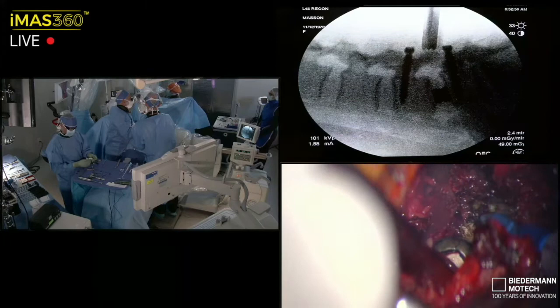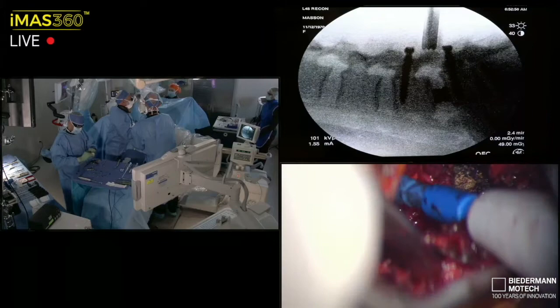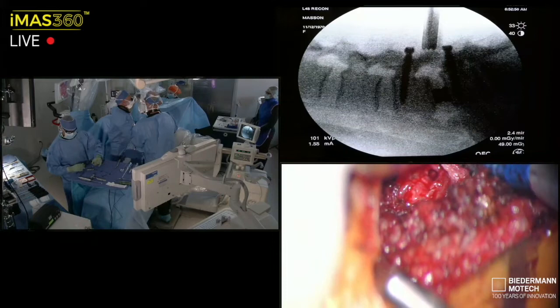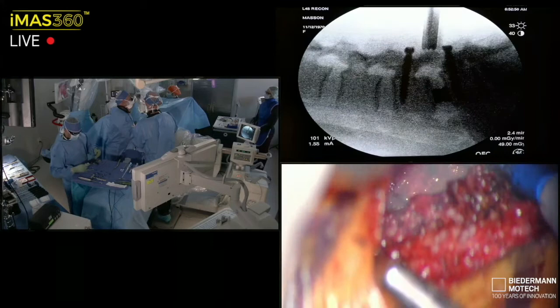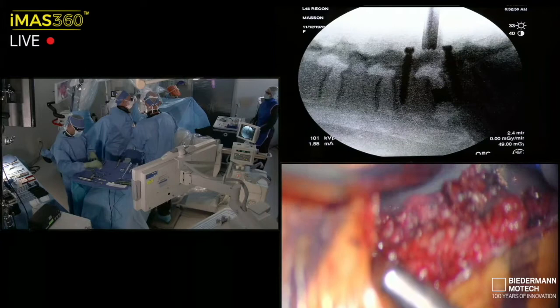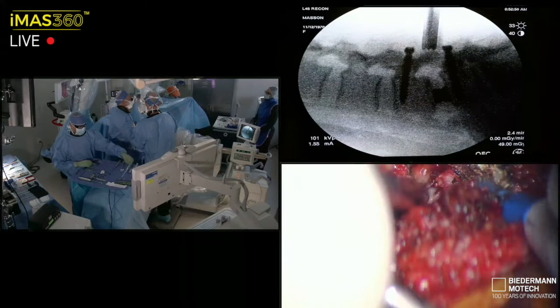I'm gonna go to the medial pedicle, carefully from lateral to medial, knowing that, particularly when I do a decompression, I take all the bone right up to the pedicle on that foramen. So it's gonna be nerve root and dura pretty close to that medial border. Again, as I go medially, we'll elevate. But there's going to be, because of her slight keloid tendency, a little more fibrosis and scar tissue here than normal. Let's take our time through that. Okay.